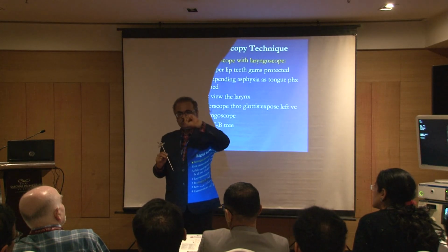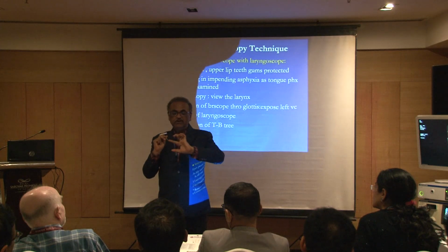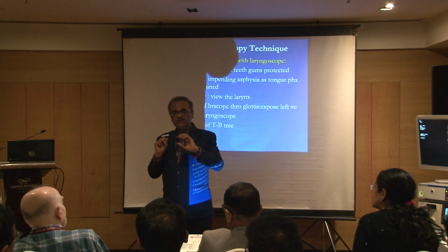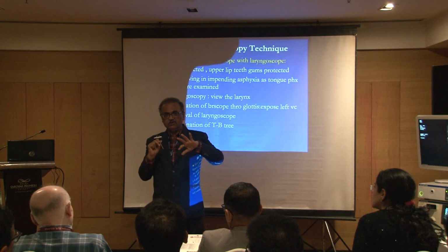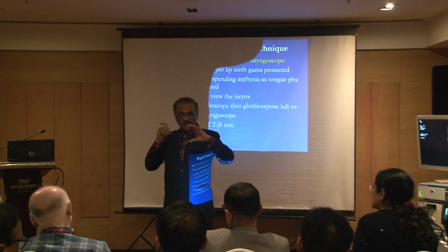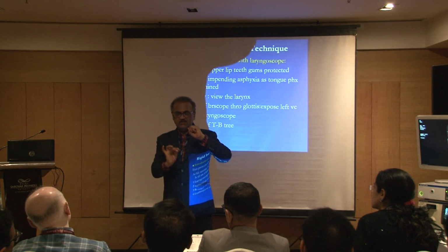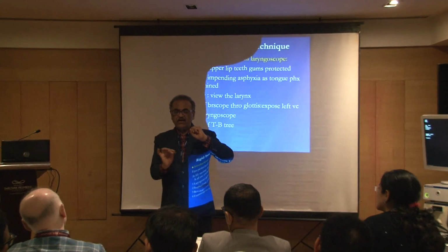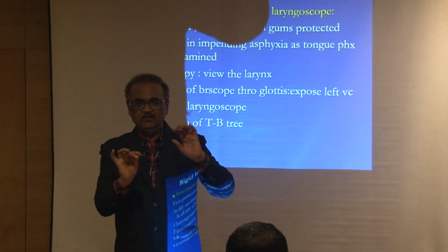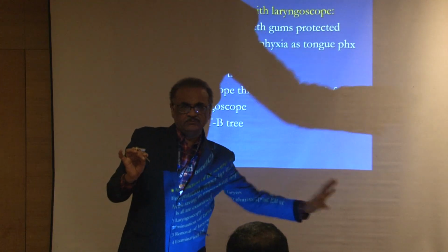Then after seeing the glottis, you have to see that the beveled end is on the left. So all the time you are seeing the left side. So introduction of the scope up to the glottis under vision, by holding at the center, is done. Then at the glottis you just negotiate to some extent and then you can enter easily. The moment you enter, the laryngoscope is out.